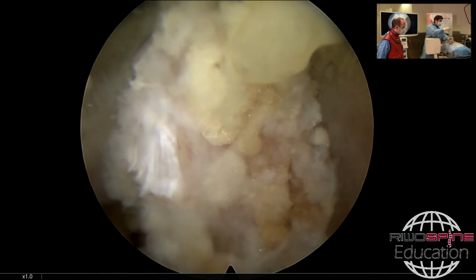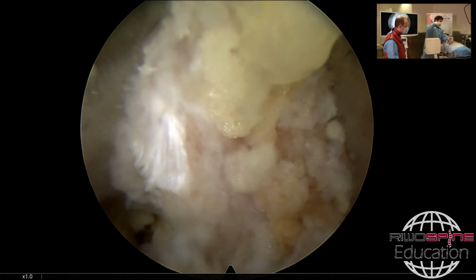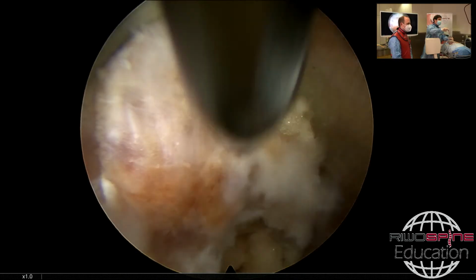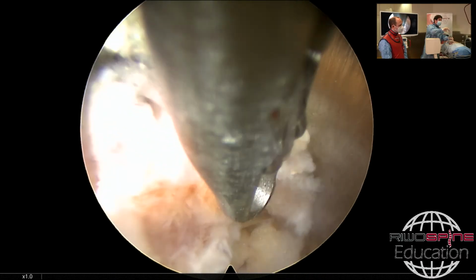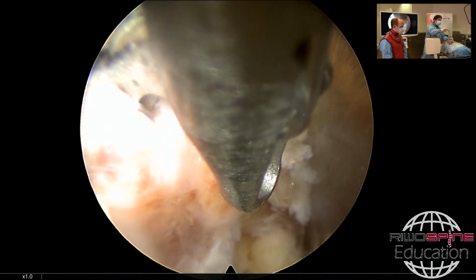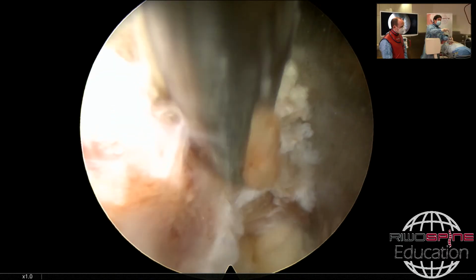And the best, can I have the scissor? Yeah, okay. The best maneuver to cut the ligamentum flavum is that. Mostly I see during the trainings the participants doing it differently, but it's not good. I open it, I press the working sleeve to the ligament to stretch it, and I open the mouth of the scissor, and I just press it on the ligament, and I catch it and cut it.